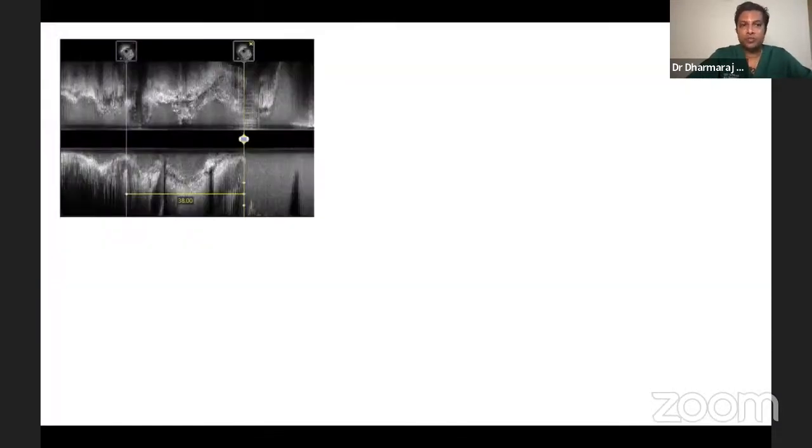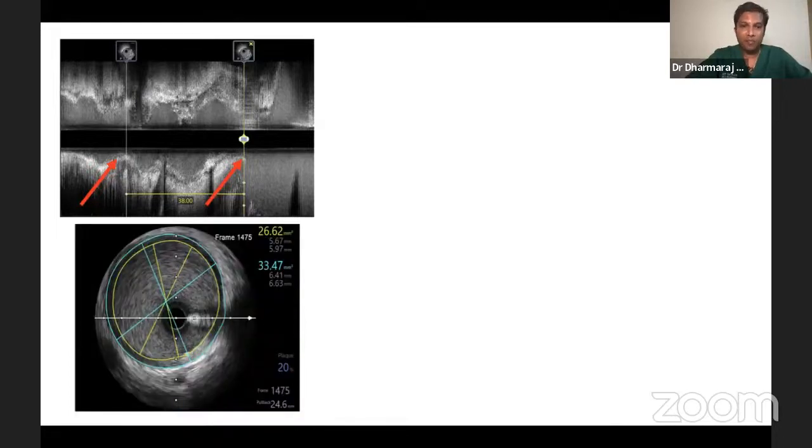Even in the most experienced of hands, to land a stent just before the myocardial bridging right at the ostial LAD is a tall order, because if your stent moves proximally or distally, you're in trouble. You do not want to land your stent in the myocardial bridging segment for fear of stent fracture, and you do not want your stent to come out too much outside the ostial LAD. What about stenting into the left main? This left main is large, almost 6 mm in size, and whatever stent you put in, even a 4 mm stent expanded as much as possible, is still going to be slightly undersized and malapposed in the left main.